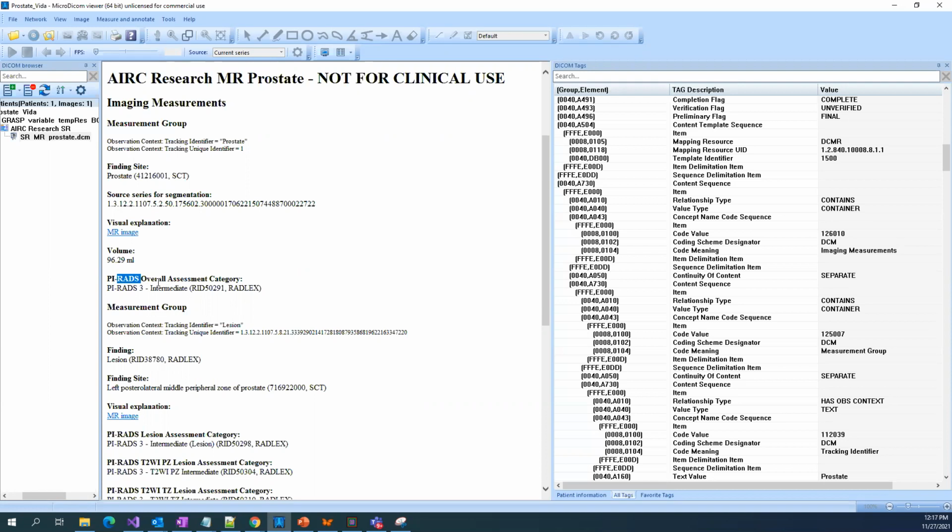There is a grade where PI-RADS has specific numbers, for example 1, 2, 3, 4. It is a fixed scale, which also indicates that if it is a 3 it is intermediate, 4 is the next level, high, and there is a specific range.